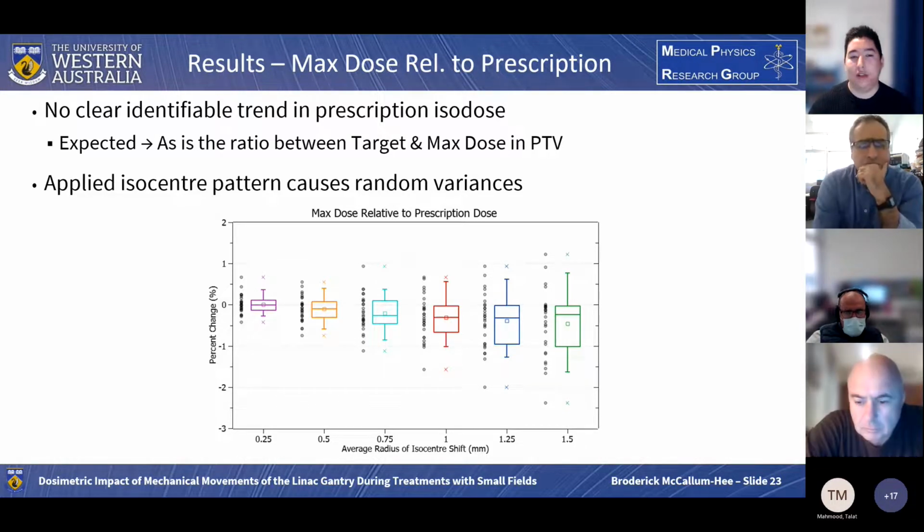In a clinical situation, an increase in the dose is generally good for tumour control. However, if it becomes too large, we risk compromising aspects such as bone structure.